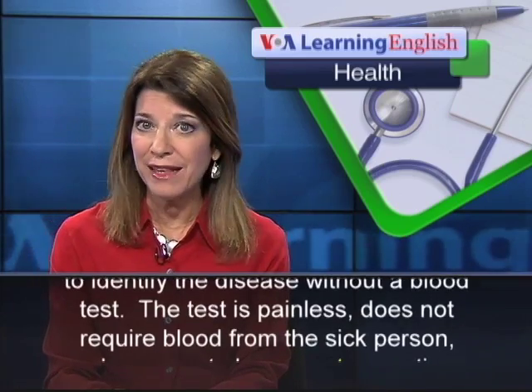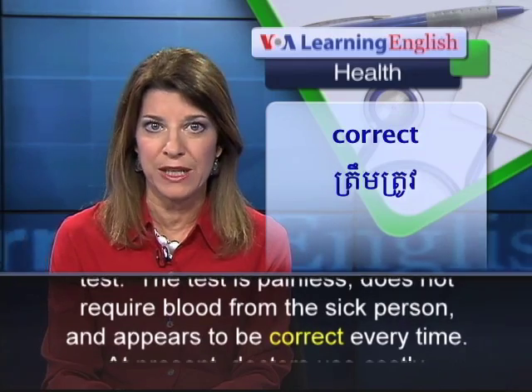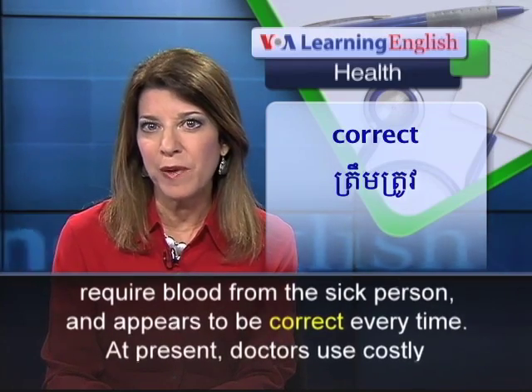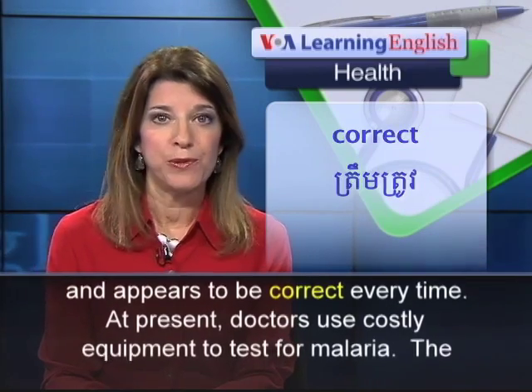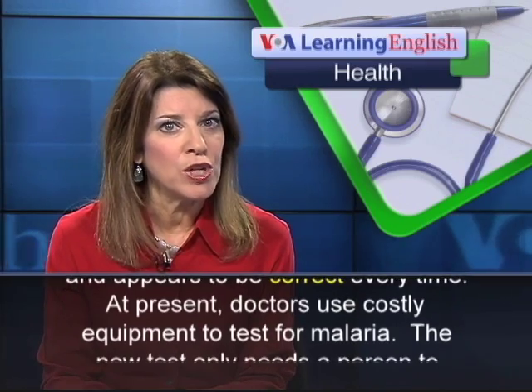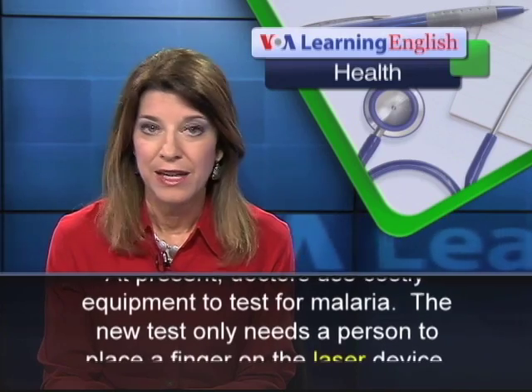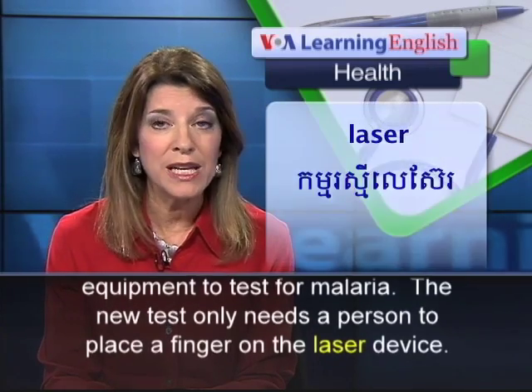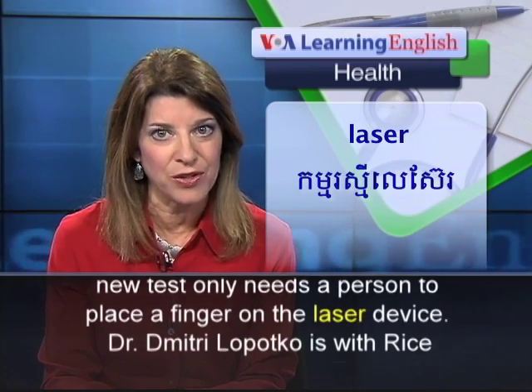The test is painless, does not require blood from the sick person, and appears to be correct every time. At present, doctors use costly equipment to test for malaria. The new test only needs a person to place a finger on the laser device.